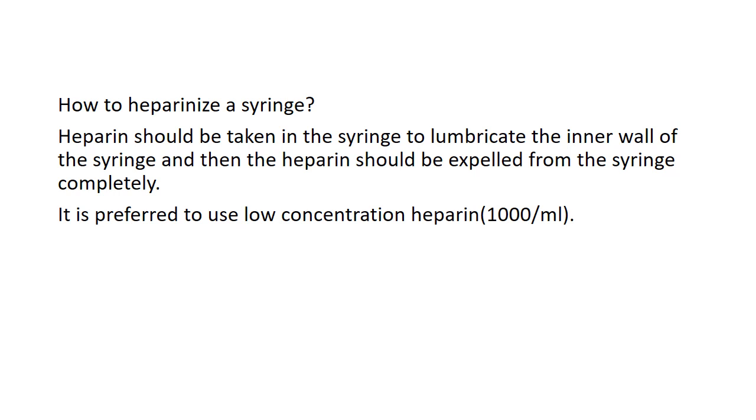And when you take a sample, you also have to be aware whether you have pulled in air from the atmosphere, because if you pull in air, there will be errors in the report. The PaO2 and PCO2 will be erroneous. So it is always important to check whether there is air in the sample. If there is air in the sample, expel it out.